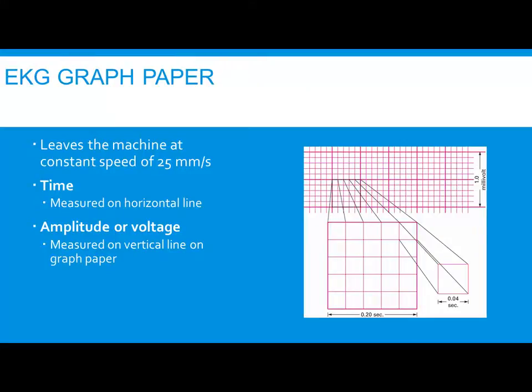Alright? So what I want you to do, I'll explain it to you in a minute, but look at the bottom here. You'll see a little bitty tick mark. Find your first little tick mark, and just somewhere up above that, I want you to count 5 of the thick pink squares. 1, 2, 3, 4, 5 up.